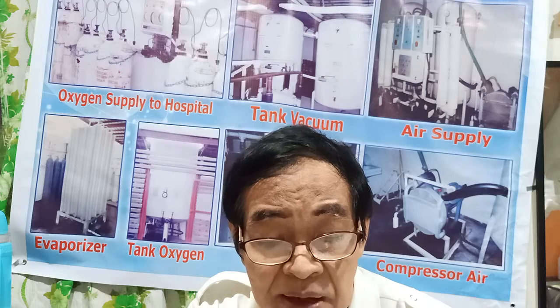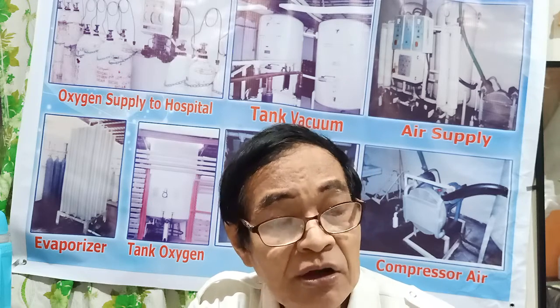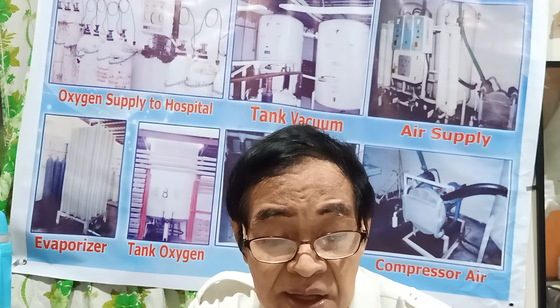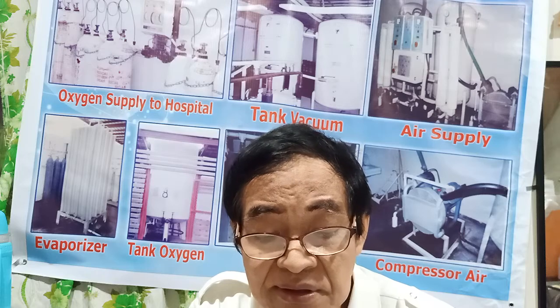And then the vacuum pump improves the insulation. The outer vessel is made of 5-8 mm pressure vessel grade steel plate.